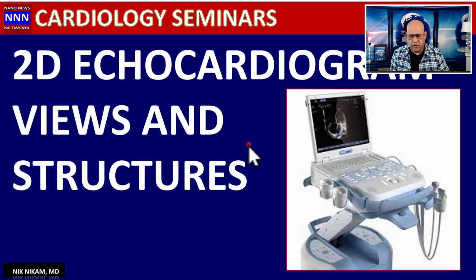I have done echocardiograms for more than 35 years. I bought an echo machine back in 1982, so you don't have to guess my age. And I have been doing echocardiograms. The last machine I had was, of course, the GE Vivid Dimension 8. So I'm going to walk you through different planes in which we take the images and what structures we are looking at and how to get various views besides the regular 2 or 3 views that are routinely mentioned. So let us begin with the main feature presentation.